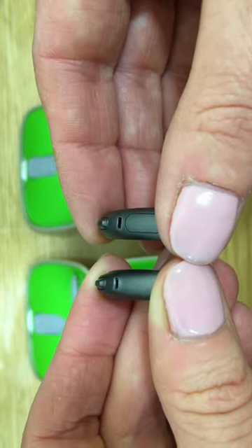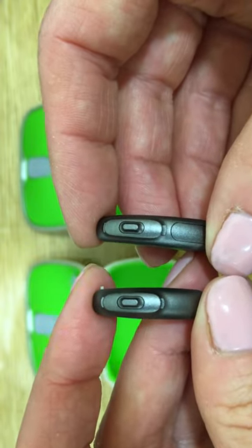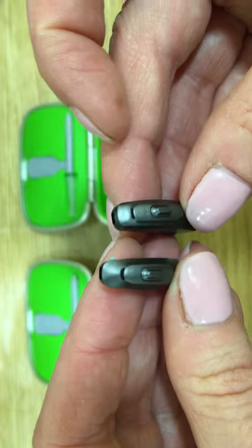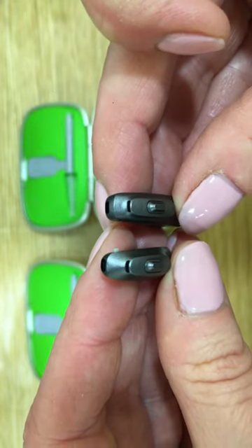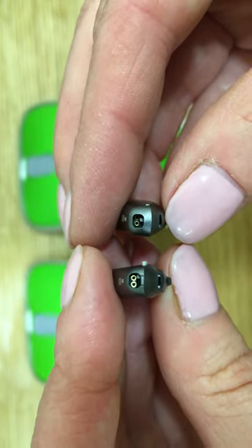Here we can see the battery system. Here we have the rear microphone port. This will be the program button or volume button. And over here we have the front microphone port. This is where we will plug the receivers in.